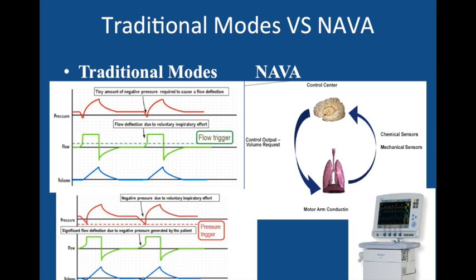This is the last step of the signal chain leading to inhalation, and this last step is subject to disturbances such as intrinsic PEEP, hyperinflation, and leakage, which make the patient need to do more effort to trigger the ventilation. But the NAVA trigger doesn't have this problem.